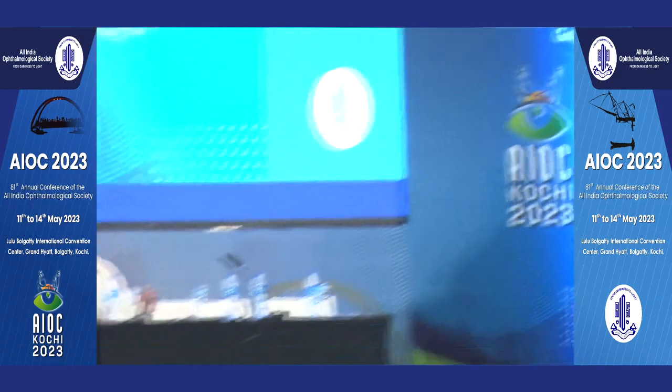Dr. Purendra said that for pre-existing astigmatism, toric IOLs have matured enough and are a very good way to go. Results are excellent, because if you don't do it, then even the distance uncorrected visual acuity is not very good. And moreover, these lenses are very forgiving. The fear is that they'll rotate. With some of the good manufacturers, even if it rotates by 5 to 10 degrees, the visual degradation is not so much, and the patient will still feel a lot of benefit. So, as I say, they are very forgiving lenses.